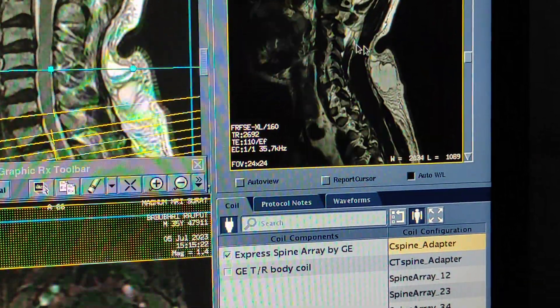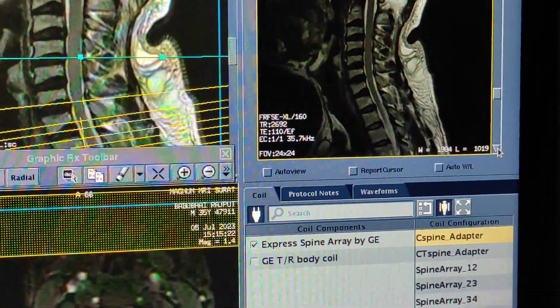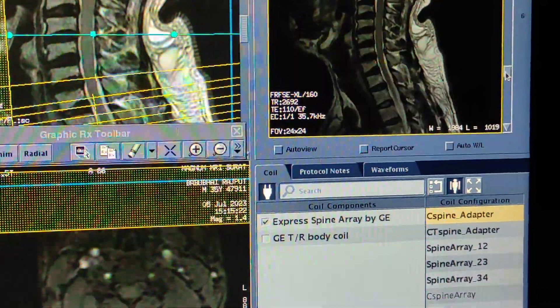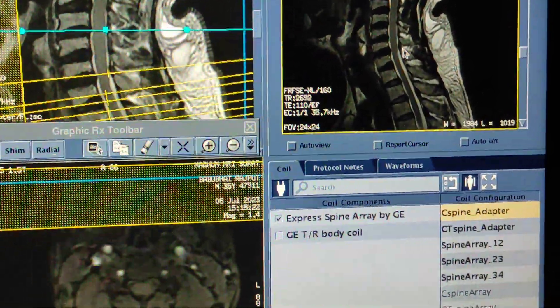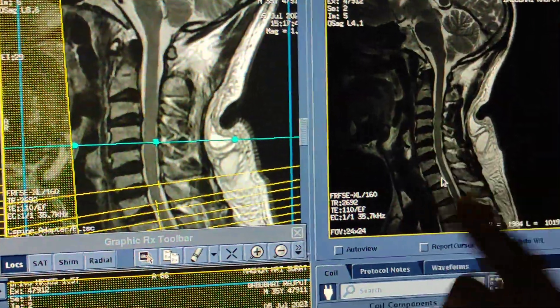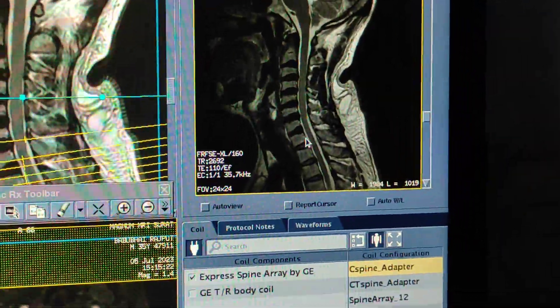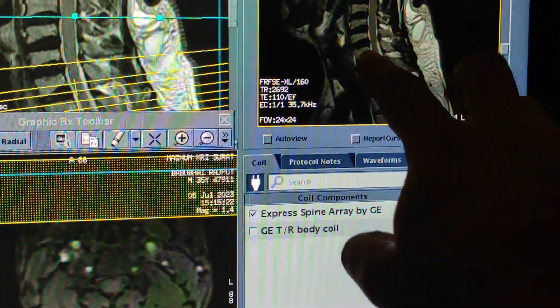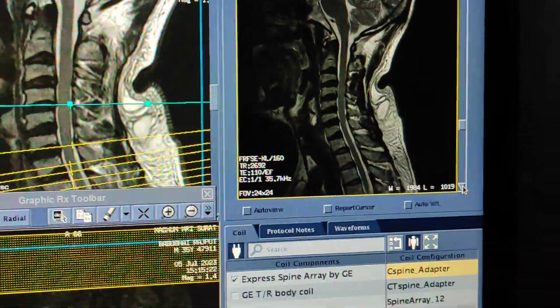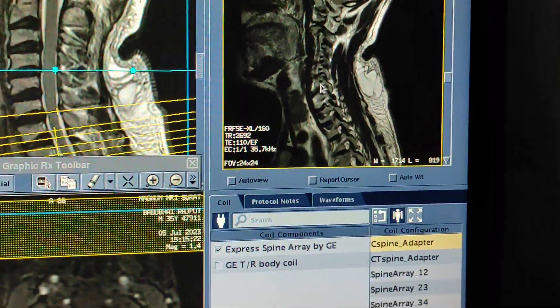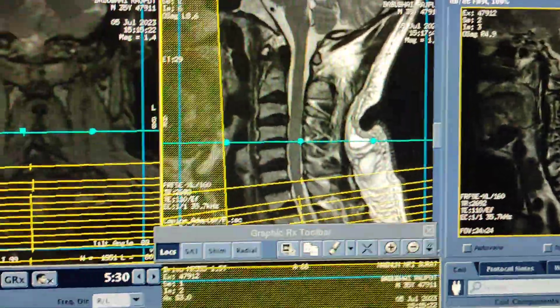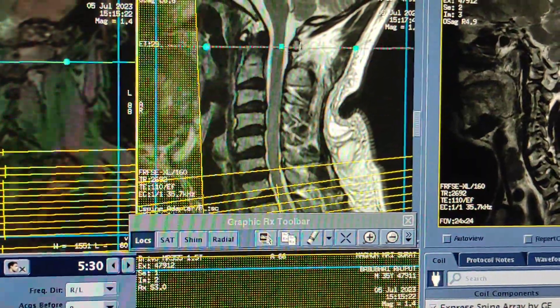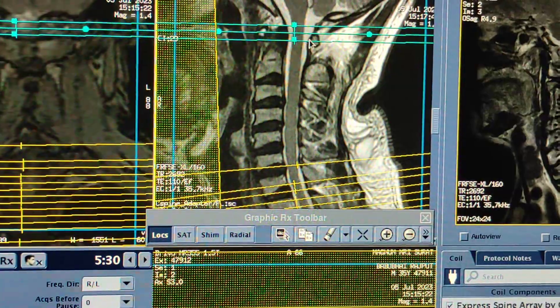First, determine from the right-to-left images at which level there is a protrusion, extrusion, or the largest bulge. If the spinal discs are normal, simply add three slices on all disc levels. Here I can see at C3-4, C4-5, C5-6, and at C6-7 level there is a foraminal disc protrusion on the right side. On that area you have to enter more images — ideally take 19 images. The flame format should be 20.